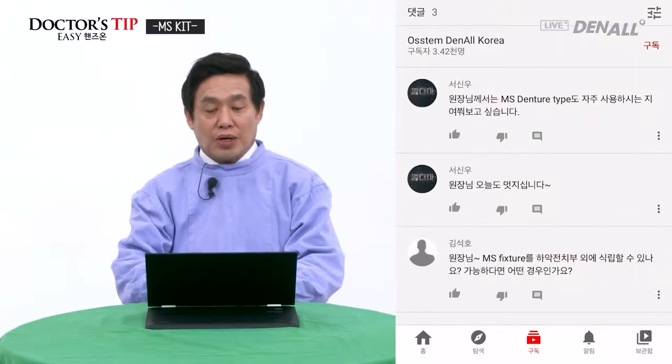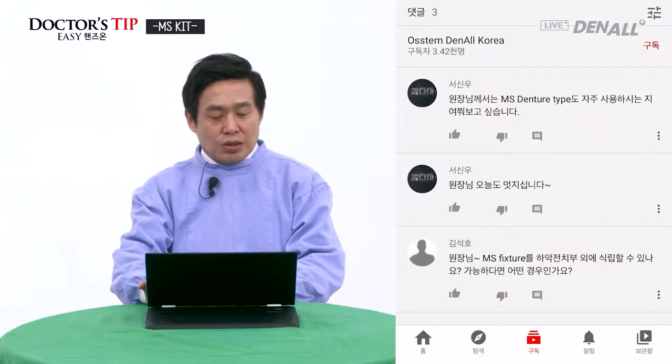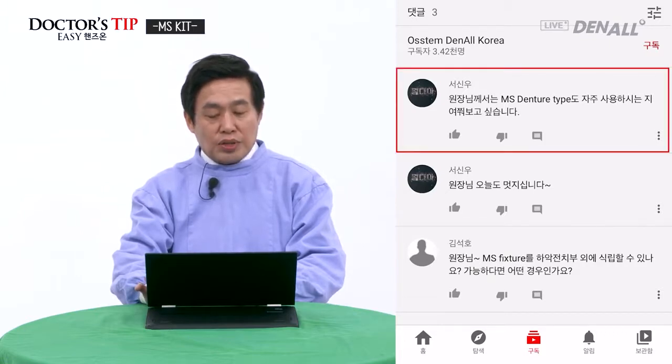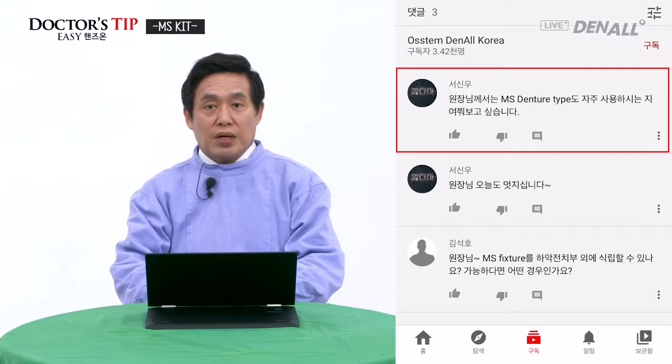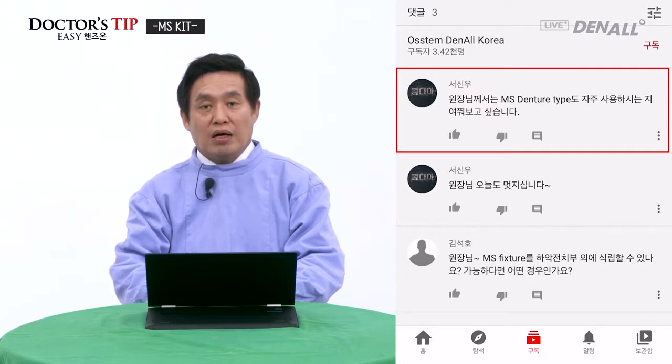So let's answer some of the questions related to the MS kit. Dr. Shinuseo says, do you frequently use MS denture type? I do believe I told you in the lecture. In the case of MS implant denture type, this implant is used for O-ring connection in an over-denture.